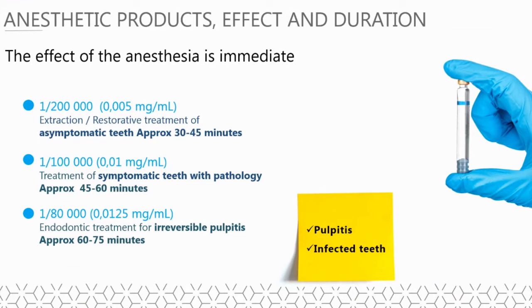Finally, the adrenaline concentration of 1 in 80,000 can be used to increase the time or for treatment of irreversible pulpitis. The duration of the anesthetic effect is normally from 60 to 75 minutes. It is important to also remember that the anesthesia is effective immediately.